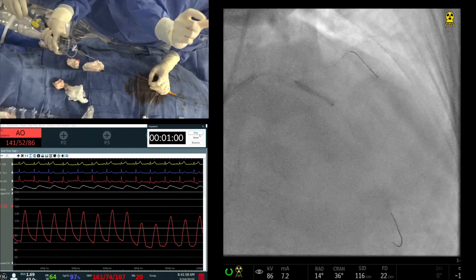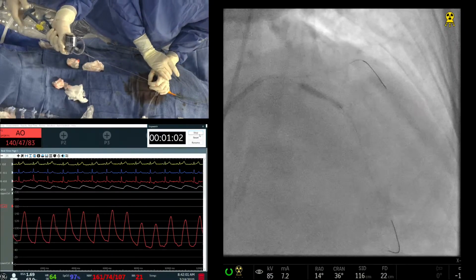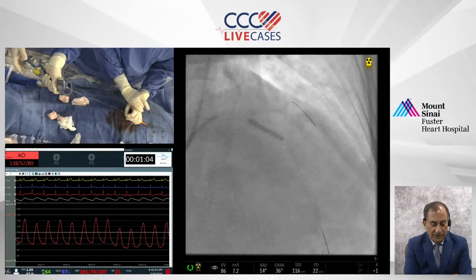So I would put a short stent in the diag. No, there is a bifurcation. Very important feedback for you. Okay, relevant information opened up. Yes.